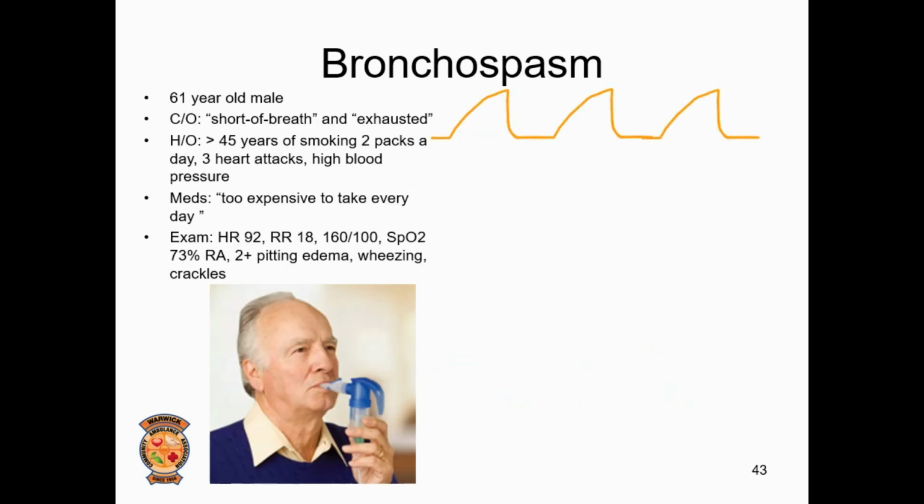Remember our patient from the beginning, the 61-year-old male who was short of breath and exhausted with several MIs, hypertension, and a significant smoking history? He said his medications were too expensive to take every day, and he was severely hypoxic with pitting pedal edema. We also heard rales and crackles in his lungs. Without capnography, one must wonder if the patient is in congestive heart failure or if he's having an exacerbation of his COPD. We know that bronchospasm is triggered by allergies, pollutants, exercise, stress, and in this case, lung disease.